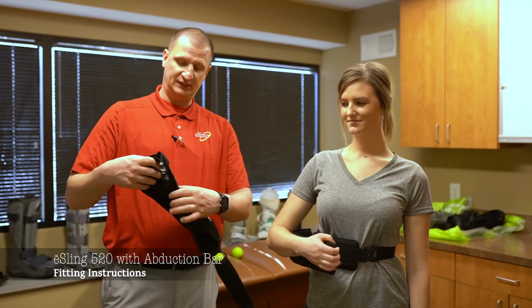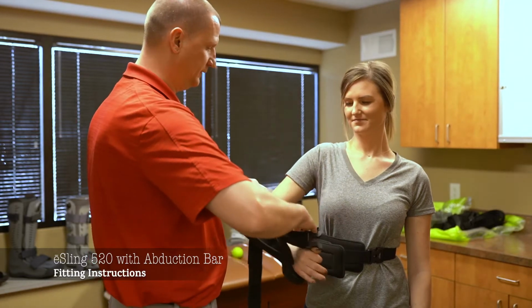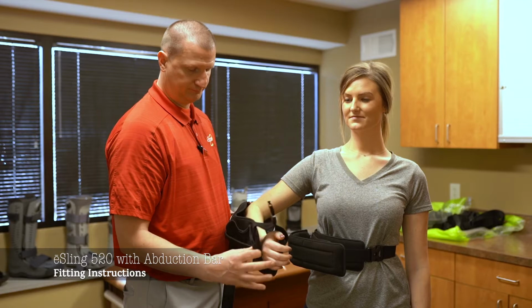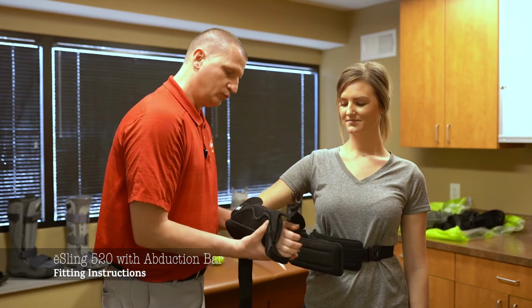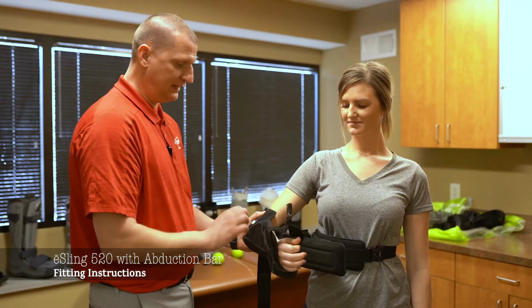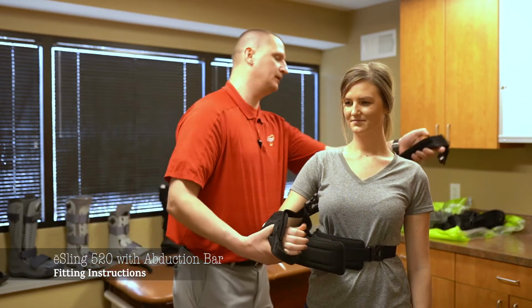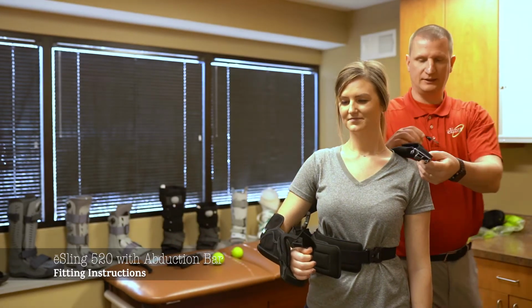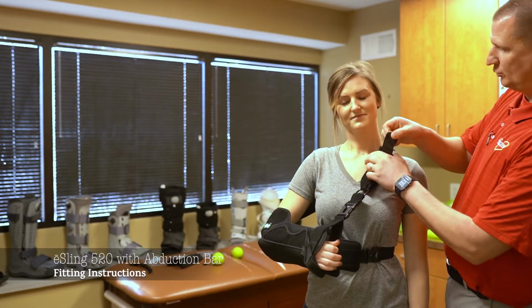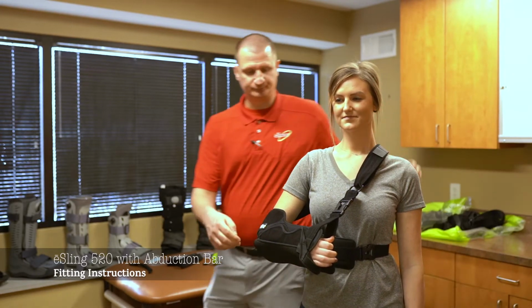Just like the 517 Express, we're going to undo the cross strap, and the patient's going to slide her arm in. We are not going to Velcro it yet to the positioning arm. Okay? Once she is within the cradle, we're going to make sure her elbow is all the way back. We're going to get her towards 90 degrees. Okay? We're going to bring this up and over. Again, this has been pre-cut, but you're able to cut the Y straps here and also along her back. Okay?